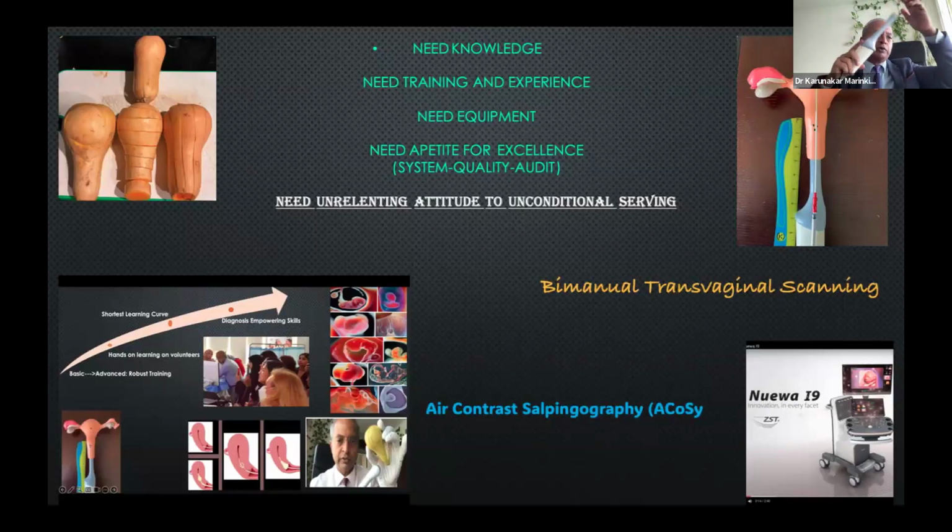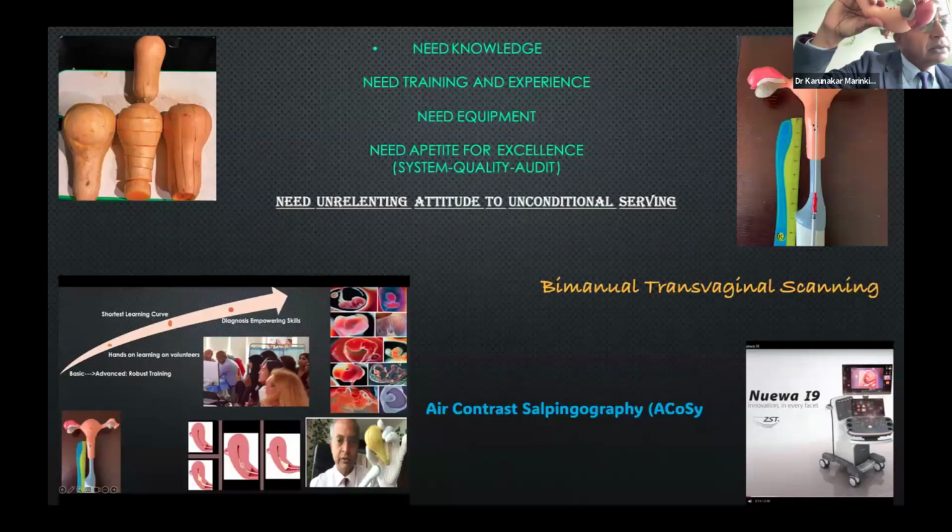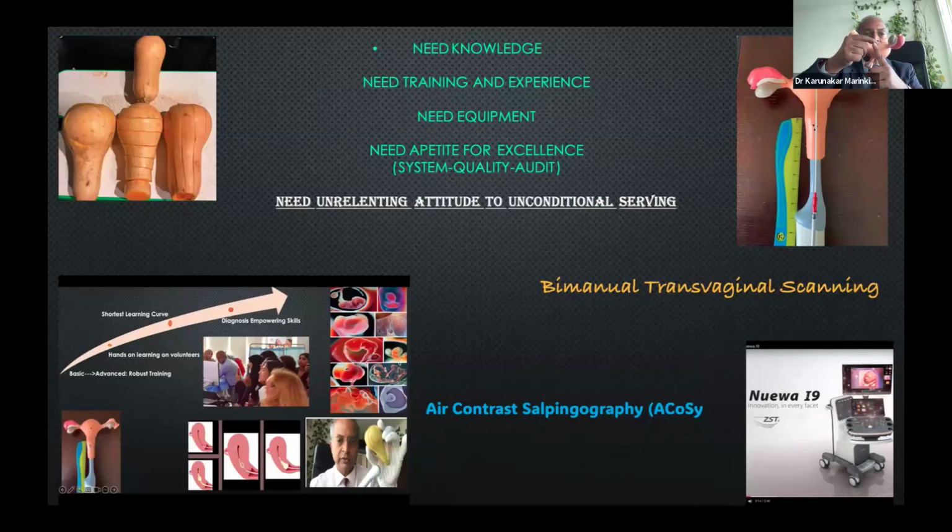It will not allow the probe to go anywhere you want, but you can bring the structure close to your probe. Then you can lower the head end of the patient so much that the entire bowel will push away, and you will have no bowel interrupting between the probe, ultrasound waves, and the organ of interest. If anything other than liquid is between the probe and the organ of interest, you will lose quality. That's why you get inconclusive findings.